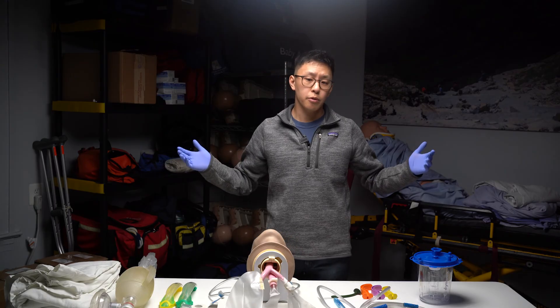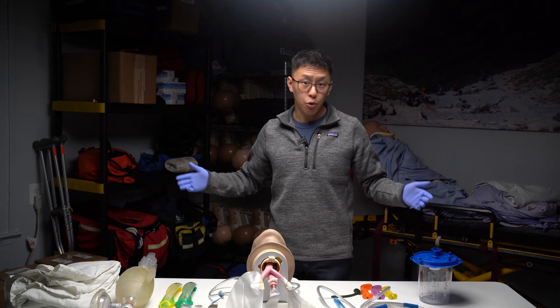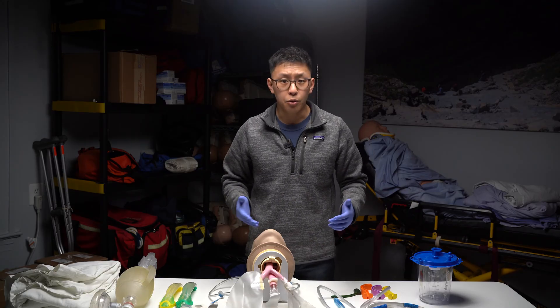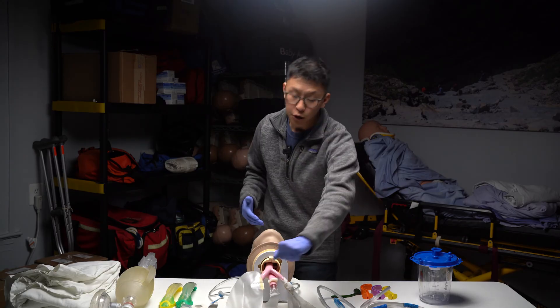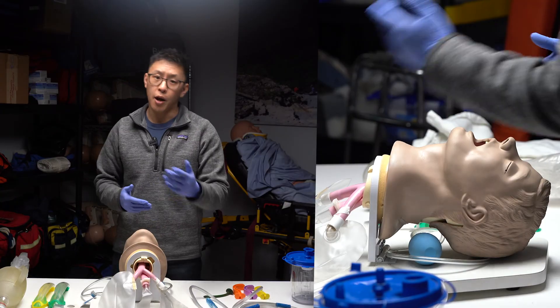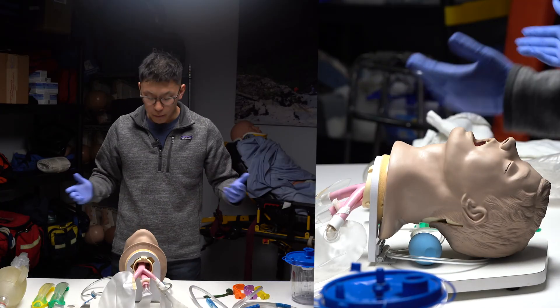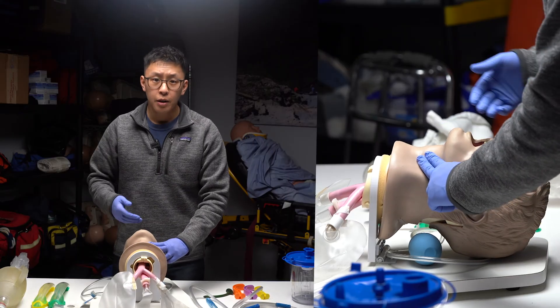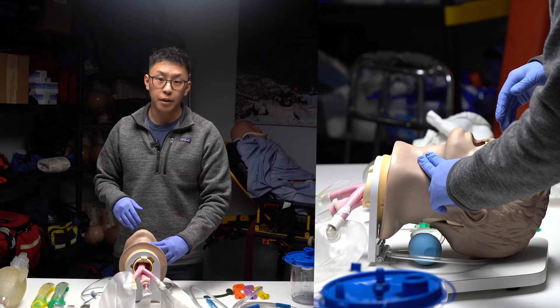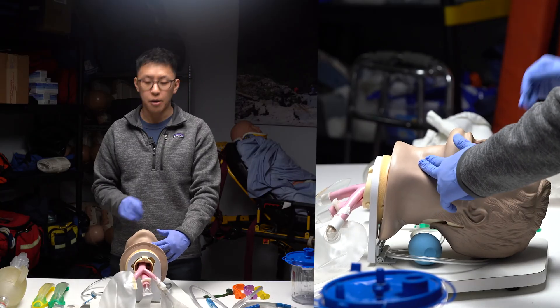Check responsiveness starting with verbal stimuli: "Sir, ma'am, are you okay?" If no response, escalate to a painful stimuli — most commonly the sternal rub. Your proctor will respond that the patient is unresponsive, at which point you escalate to checking for a pulse for no longer than 10 seconds. Because this is airway management, your patient will have a pulse, so they don't need CPR.